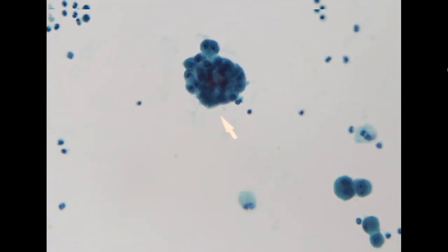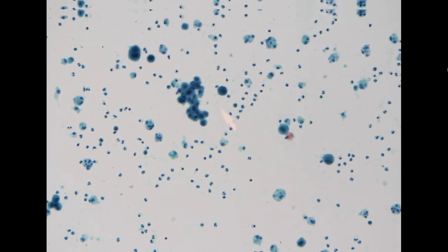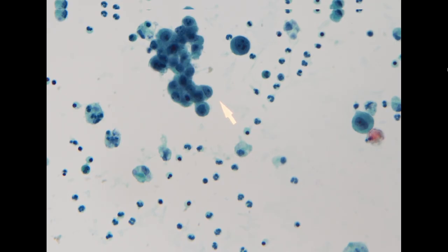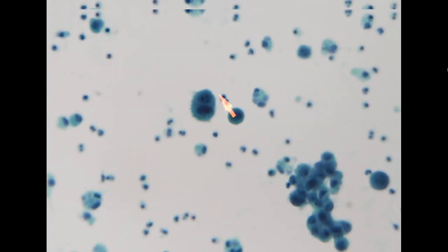Just on low power, it seems to be a lot of aggregates, tight clusters. It looks like metastatic adenocarcinoma. But when we get to high power, these clusters of cells do not show the typical morphological features of an adenocarcinoma, which are enlarged nucleus, vesicular chromatin, prominent nucleoli, bubbly cytoplasm, and three-dimensional architecture. It really doesn't show those features at all.